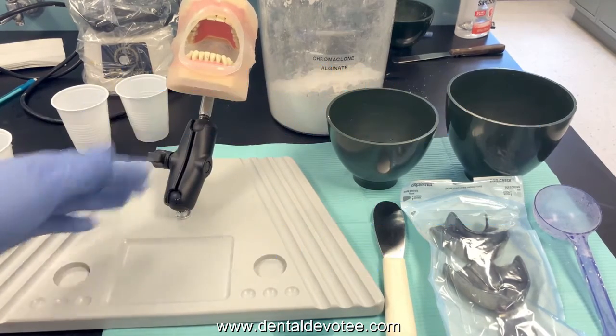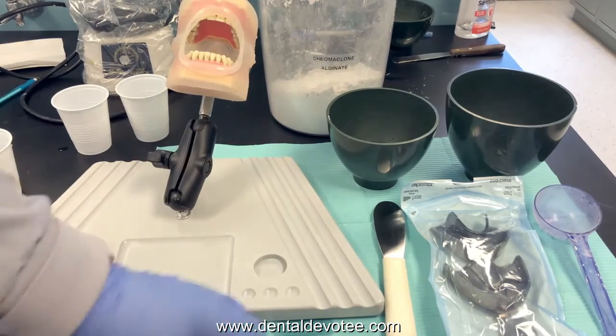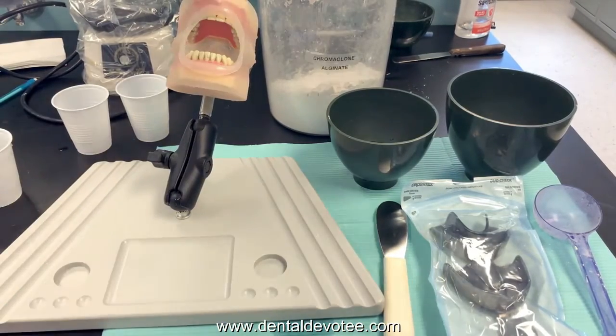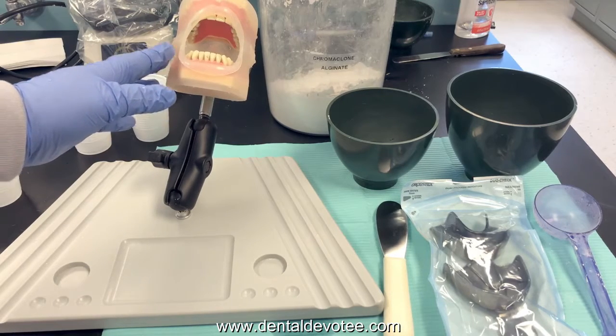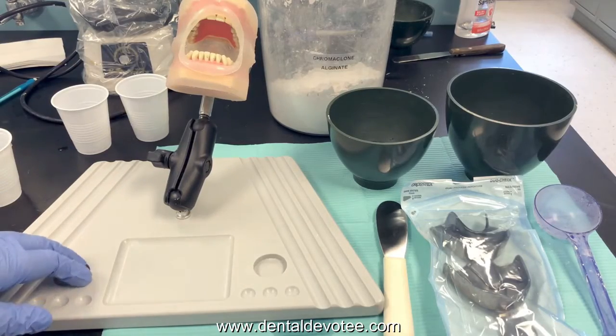Explain the procedure to your patient. Let them know what to expect even if they've had impressions before — let them know specifically what you're using. You can tell them: I'll be trying in these empty trays to make sure we get a good fitting tray. Once we're ready for the material it will smell like bubblegum, won't have much of a taste, might feel cold, and will have a thick consistency like putty — like thick mashed potatoes or thick pudding. Once it's placed in your mouth, breathe through your nose and it has to stay in for one minute until it sets up. Then give the patient an opportunity to ask any questions.